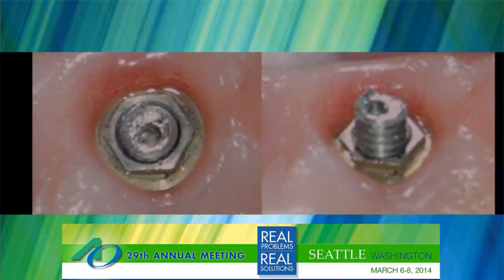So I try to stay concentric all the way. By staying concentric, you're taking the screw body out. You're not risking any threads, even in a total removal. I haven't had to do it for several years because of this technique, however.